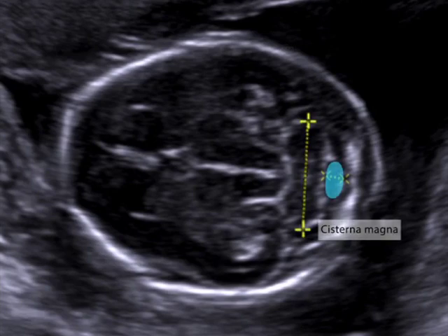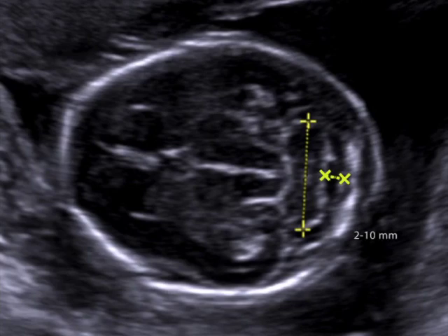The cisterna magna is a fluid-filled space behind the cerebellum that is measured by placing calipers just inside its borders. The cisterna magna normally measures between 2 and 10 millimeters.